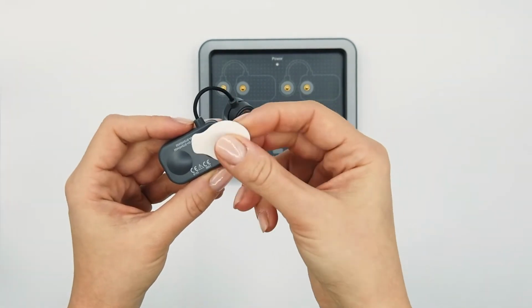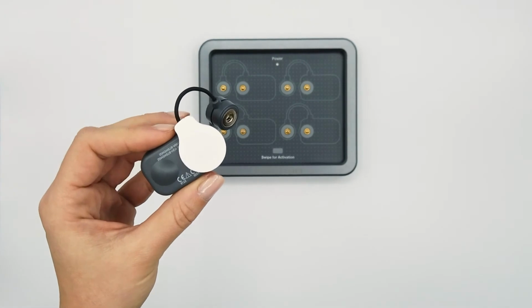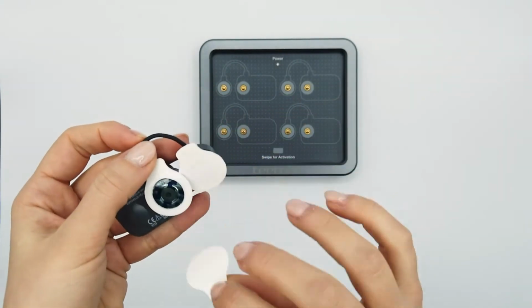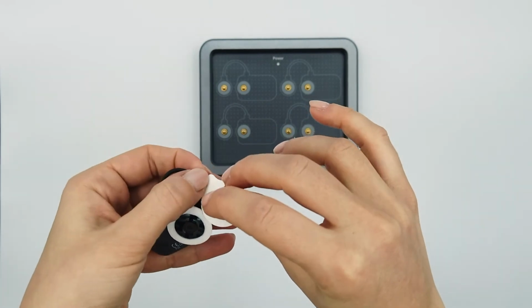To apply a probe, the pre-gelled electrodes must be attached. Please make sure that the distance between the electrodes does not exceed 2 centimeters. When removing the film, take care not to damage the gel part. The probes must be applied parallel to the muscle fibers as shown.